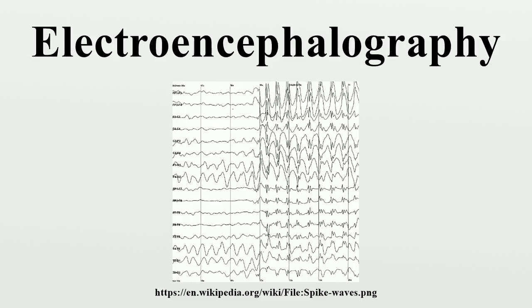MEG and EEG both detect activity below the surface of the cortex very poorly, and like EEG, the level of error increases with the depth below the surface of the cortex one attempts to examine. However, the errors are very different between the techniques, and combining them thus allows for correction of some of this noise. MEG has access to virtually no sources of brain activity below a few centimeters under the cortex. EEG, on the other hand, can receive signals from greater depth, albeit with a high degree of noise.